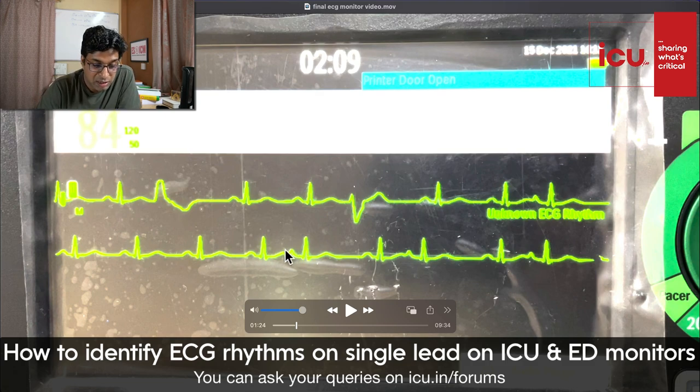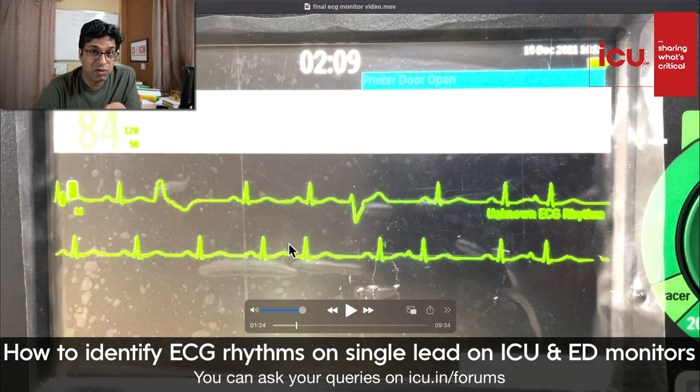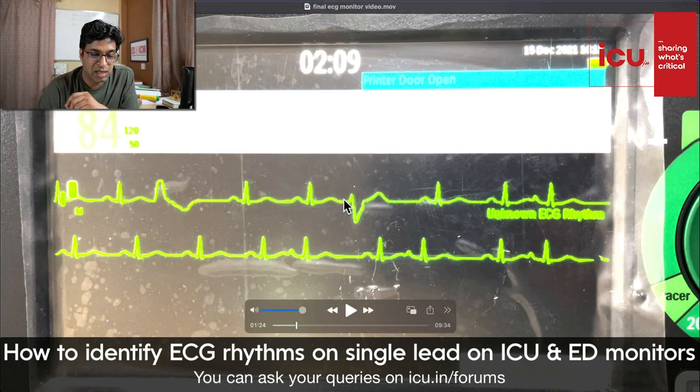So this has not been generated in the SA node, because the P wave morphology is different from the sinus node P wave. So it has been generated in a place other than the SA node. That's why it will be an atrial rhythm. We'll call it atrial rhythm, and it is a narrow complex and it has come prematurely. So it will be a premature atrial complex or contraction. So PACs, these are PVCs and these are PACs.